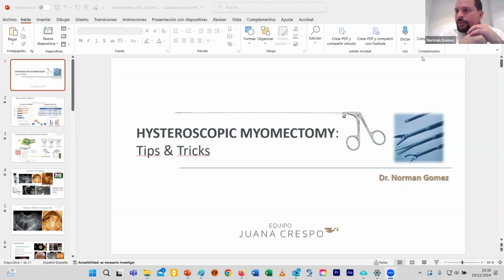And in the cervix, you don't have too much problem for the healing inside the uterine cavity. For example, the typical pathology is an isthmocele. An isthmocele you cannot solve with a scissor, at least I don't know the way to do that.